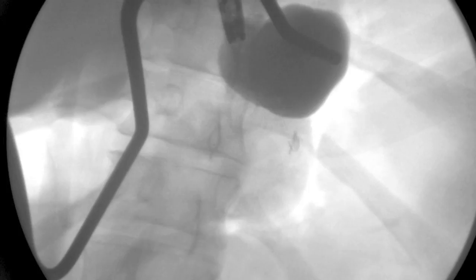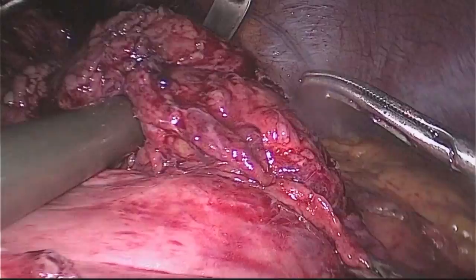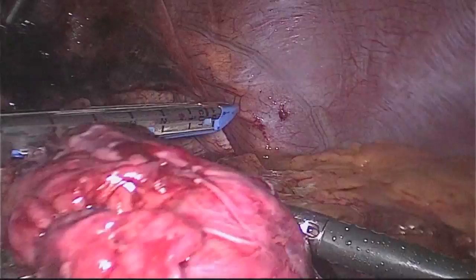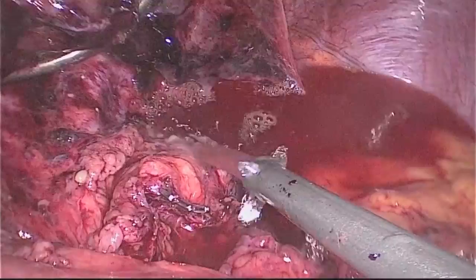The decision was made to revise the patient to a gastric bypass. A paragastric dissection was performed and the sleeve divided above the area of stenosis. The pouch was verified and quickly tested for a leak.